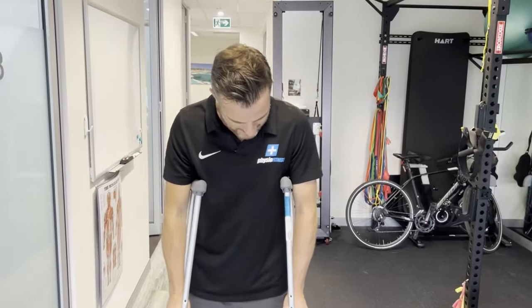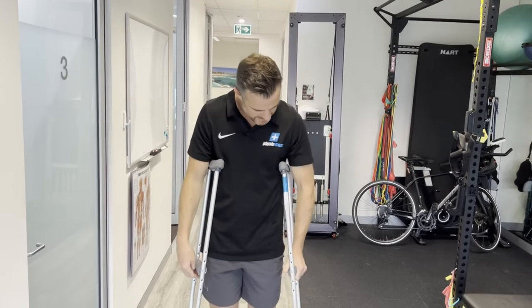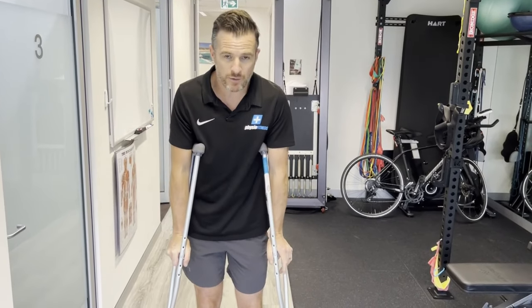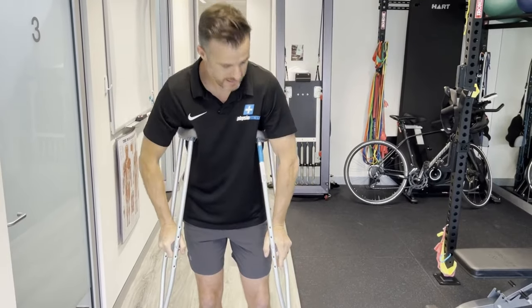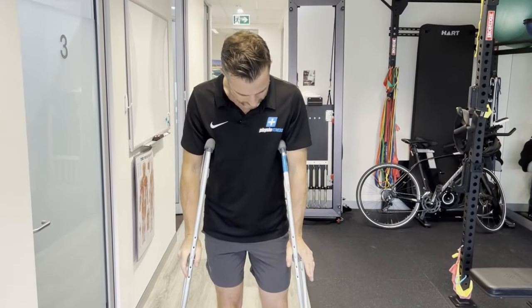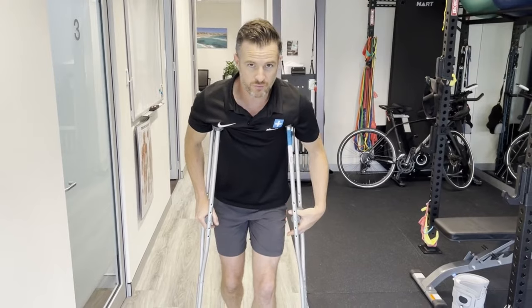You need the handles at the right height. The crutch length determines how high the top goes, and the handle position determines how high your hands sit. If it's too low you'll drop down; too high and you'll bend your elbow. You want a straight elbow so you can lock it and pull the crutch into the side of your body, using your lats to load bear and take weight off your leg. The worst thing you can do is rest down on your crutches.